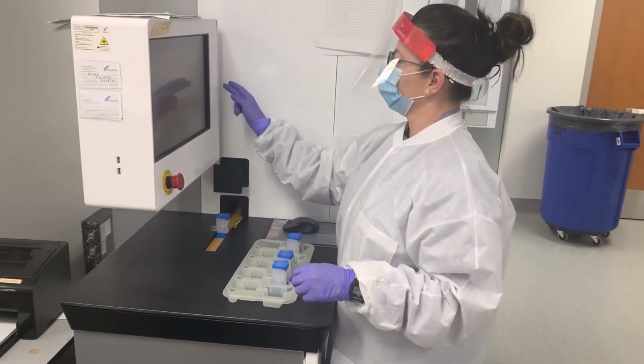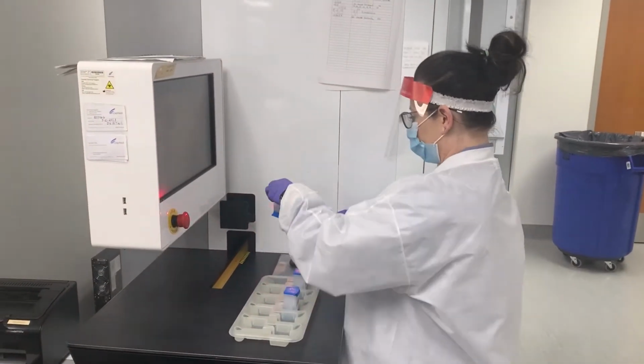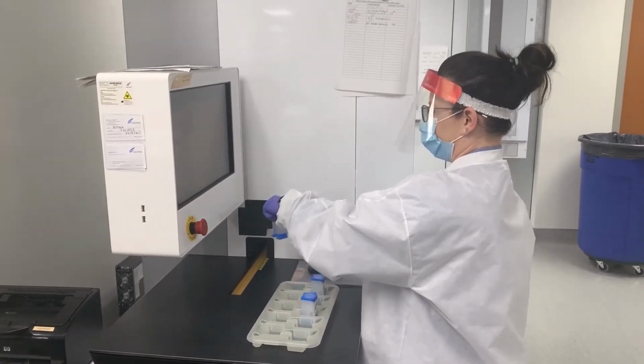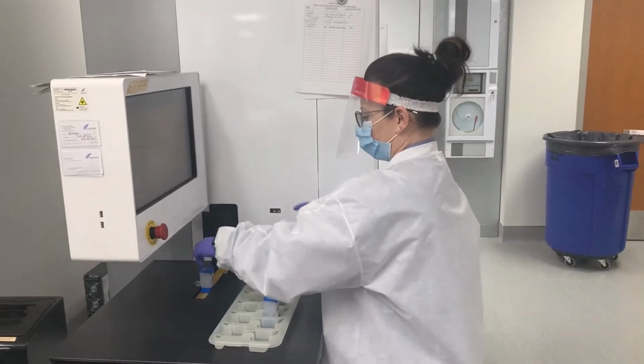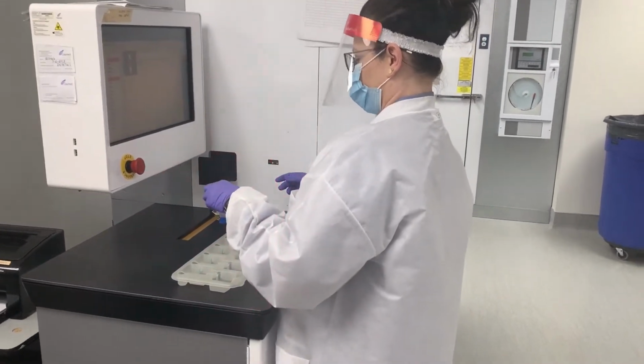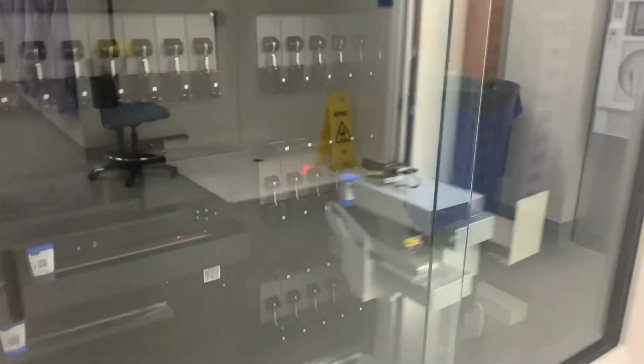So Jess is now scanning her cartridge and scanning her patient label, and then she is loading the cartridge into the instrument. And the instrument has a mechanical arm that moves over and picks up the cartridge and puts it into the module.